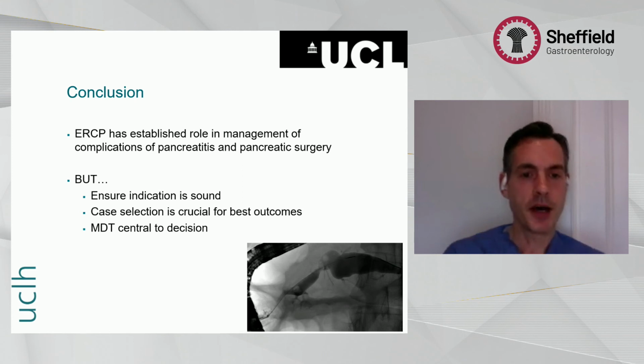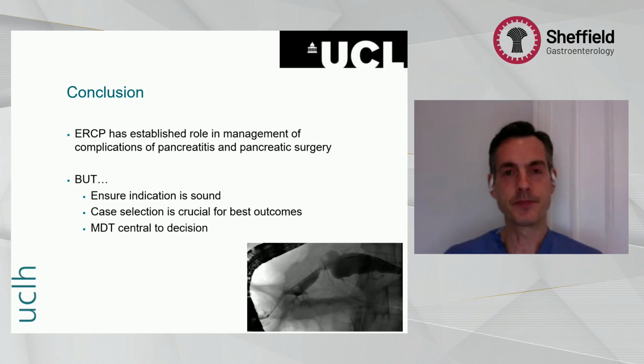So to conclude, I think ERCP does have an established role in the management of complications of both pancreatitis and pancreatic surgery, but case selection really is key here. You need to ensure there is a sound indication for intervention. I think case selection is so crucial that all of these should be discussed in a multidisciplinary meeting with our radiologists and our surgeons and our endoscopists. And happy to take any questions at that point. Thanks very much.